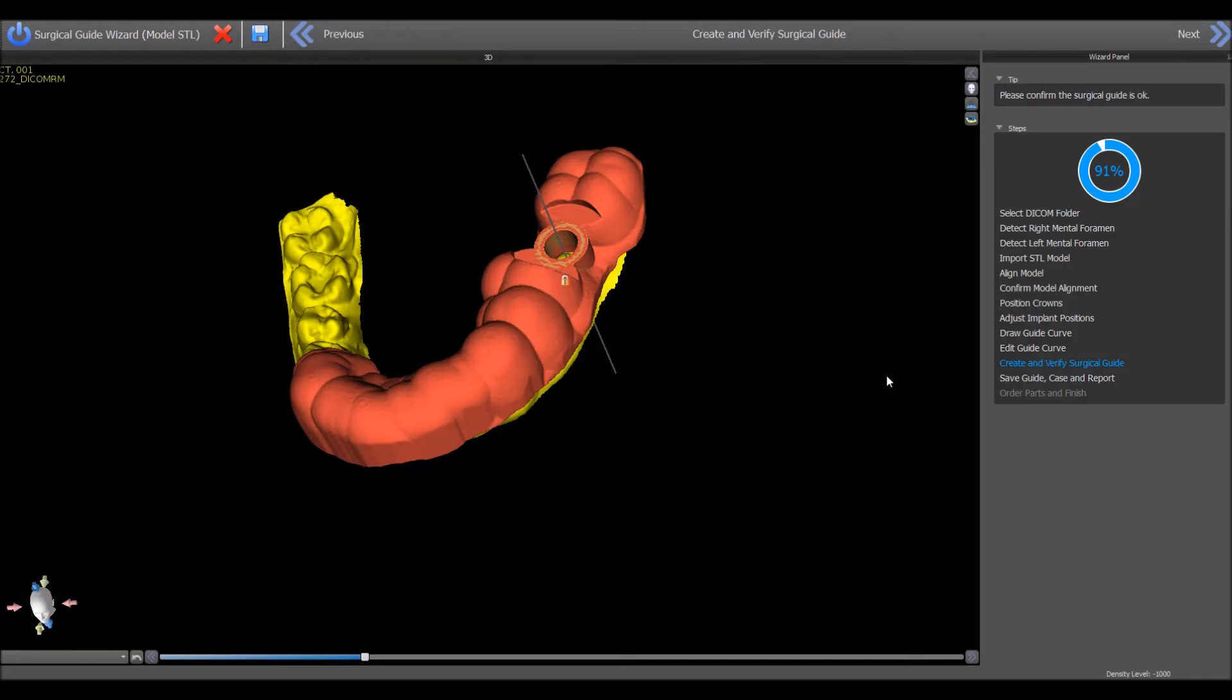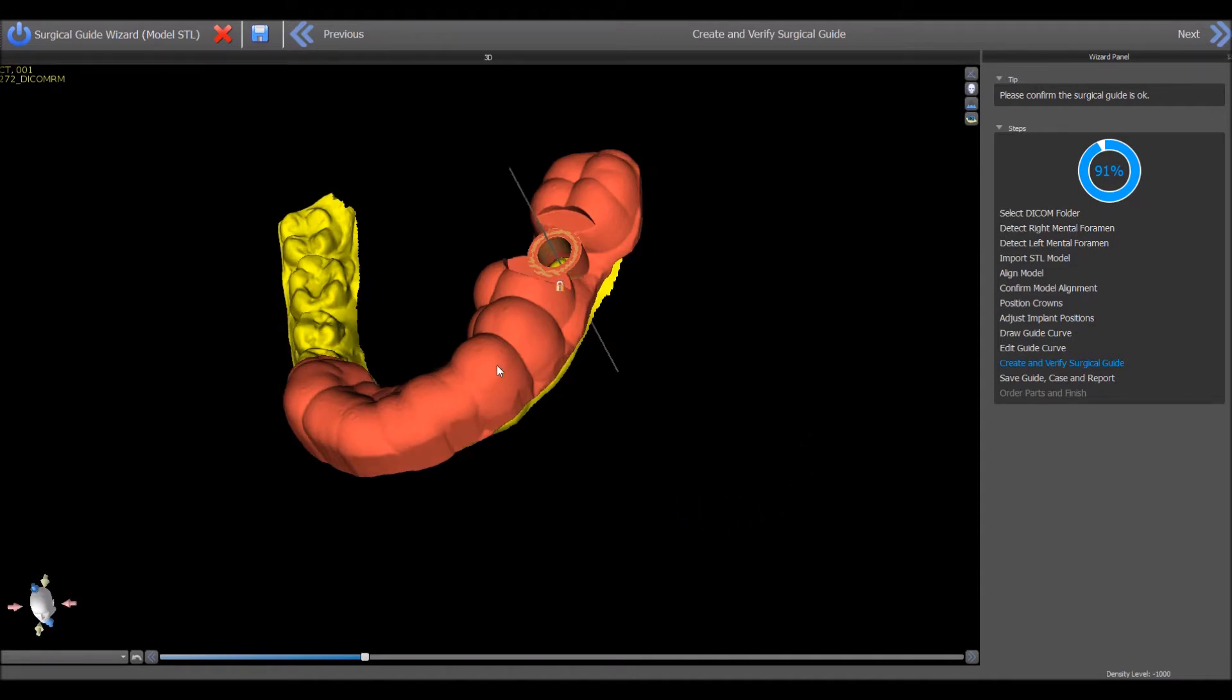We have gone through the wizard process and have reached the step where the surgical guide is visible on the screen. Move your mouse to the location on the surgical guide where you would like to add a window. Right click on the surgical guide and select add window.